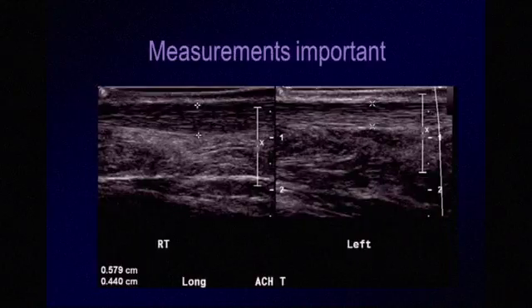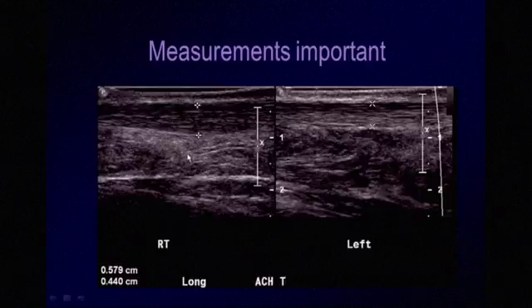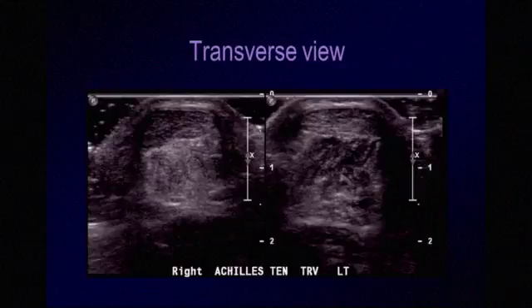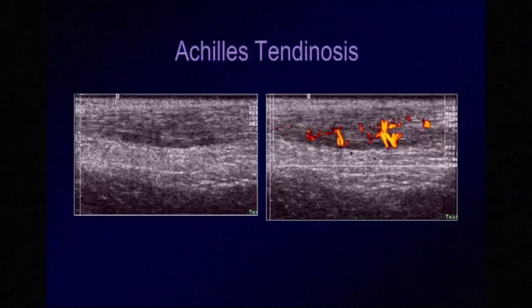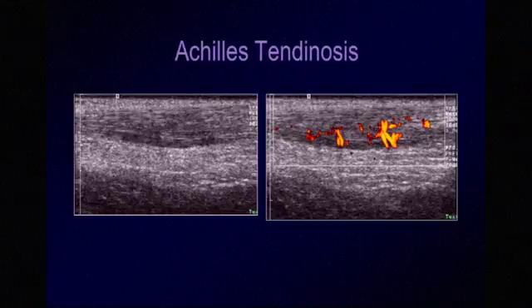Measurements can be useful when you're not sure if you're looking at pathology — you may see a difference with the unaffected side. Even very small measurement differences may be relatively significant. On the transverse view, a normal tendon has a football or ovoid shape and is uniformly hyperechoic, whereas the tendinotic tendon has focal thickening of the medial aspect, which is the more common location. With tendinosis, we may also find increased vascularity on power Doppler imaging. Always avoid compressing vessels with a heavy hand during the scan.